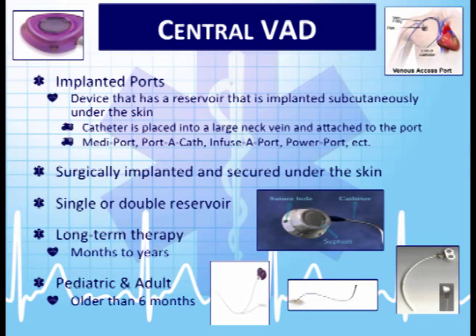So the implanted ports have a reservoir that's implanted subcutaneously underneath the skin, and the patient may be taken to the OR, sedated for this procedure to be done, using a large neck vein, and then they attach a port.